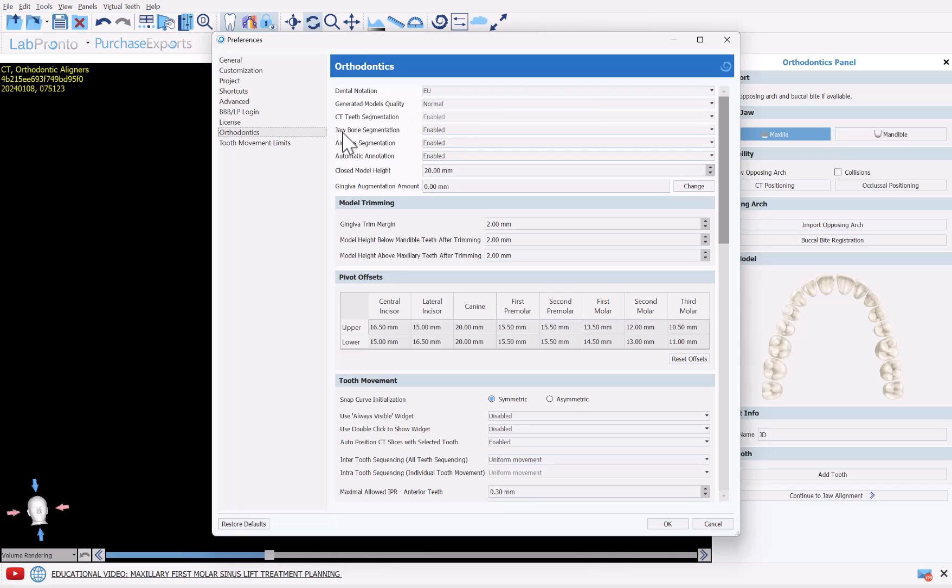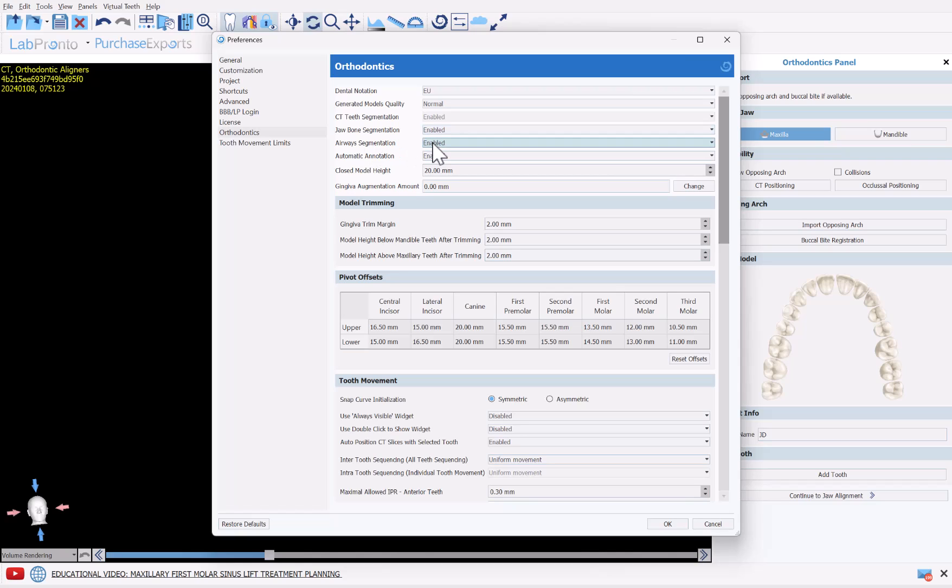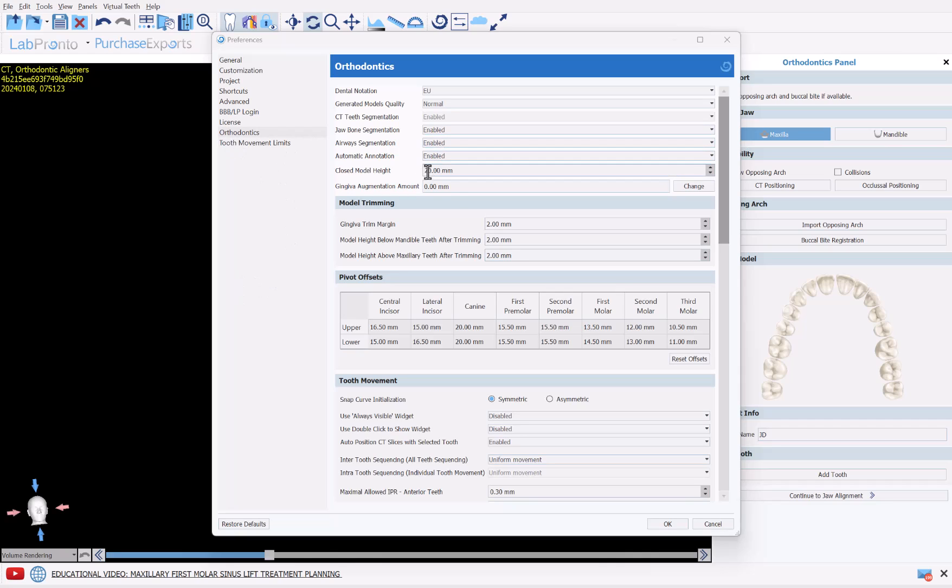The options for jawbone segmentation, you could choose if you wanted to run by default in every case as well. And you could choose regarding airway segmentation if you'd like it to run by default in every case as well. If you'd like an automated process to run and you see that it is not running or vice versa, where it is running but you don't feel it's necessary for every case, then you would like to go into Orthodontics and change the options that you have right here.